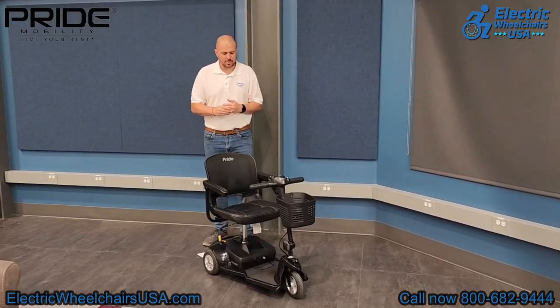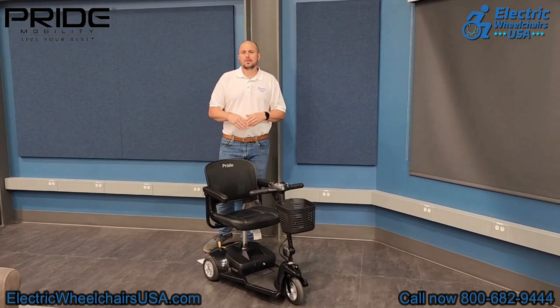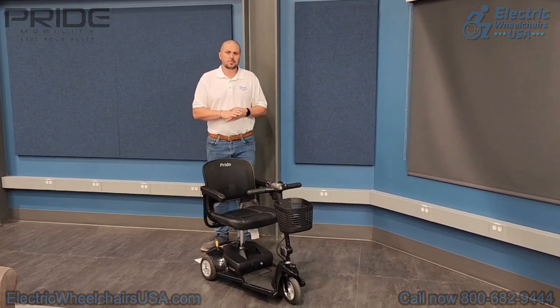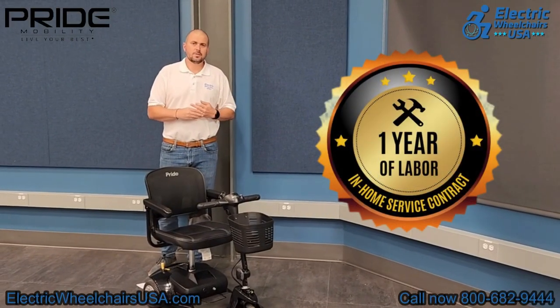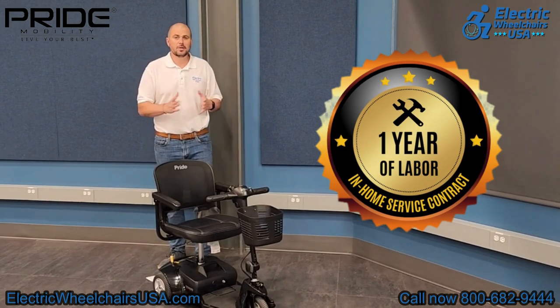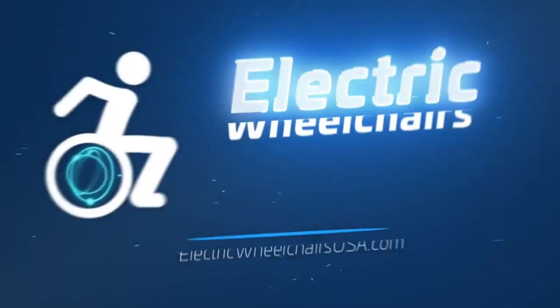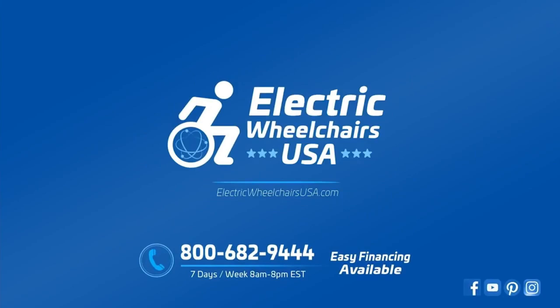In conclusion, if you're looking for a practical and affordable three-wheel mobility scooter made by one of the trusted brands in the industry — Pride Mobility — the GOGO Ultra X is a great choice. They have one of the best warranties in the industry, including one year of in-home service. If it's a warranty-approved claim, Pride will dispatch a technician to your home to diagnose and resolve the issue. For questions, call 1-800-682-9444 or visit electricwheelchairsusa.com.